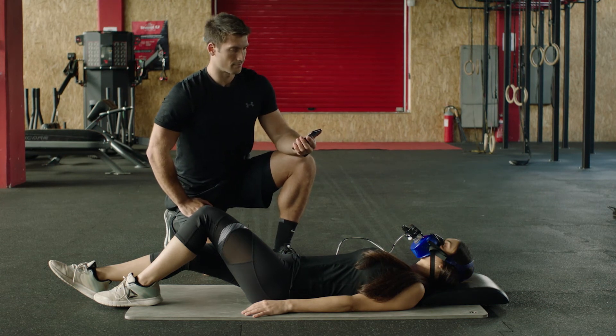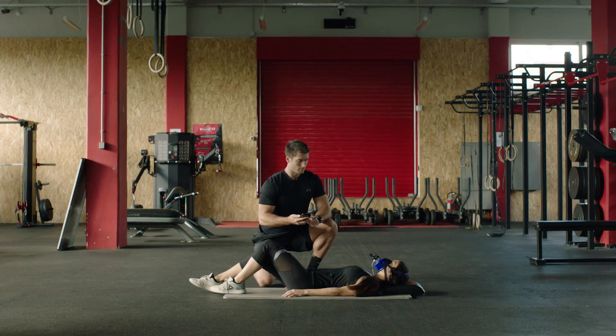They should not have completed any intense exercise for the last 24 hours. Water is allowed within the 5 hour window prior to the test.